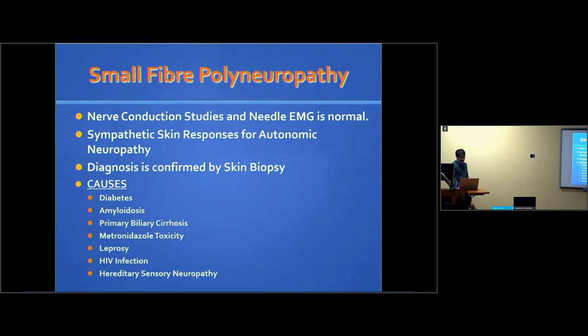You can see that Joe sent me this patient, a 62-year-old patient for left upper extremity pain and sensory symptoms. And we did the testing. So we did the motor nerve conduction studies.